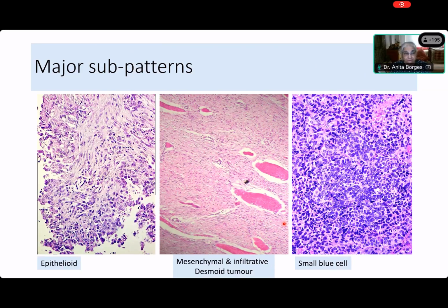Yes, ma'am. I think that those who answered first and third are right. Because in the middle tumor, I can make out that these are fibroblasts, myofibroblasts. I don't have an issue with that. I know when I look at this that this is well differentiated. You can see the tumor is making collagen, and this is a desmoid tumor. You may not be able to tell because you haven't seen desmoid tumors, but there's nothing poorly differentiated about that. It would be like my showing you a leiomyoma and you saying it's poorly differentiated. It cannot be. It looks like a smooth muscle tumor. Okay, leiomyosarcoma, which you can't tell, but the middle tumor is differentiated.